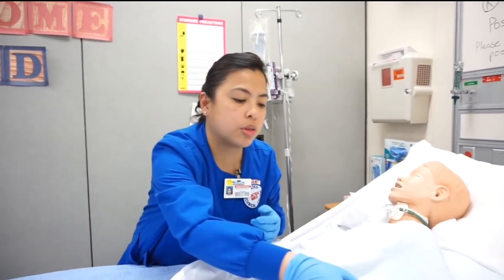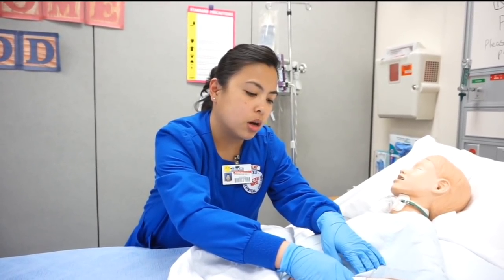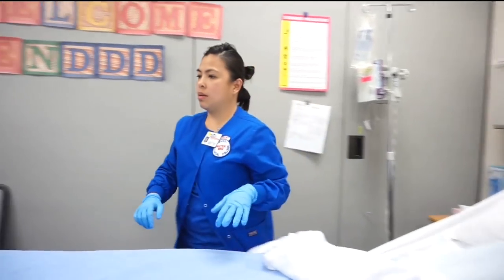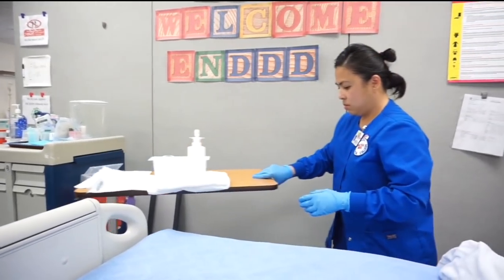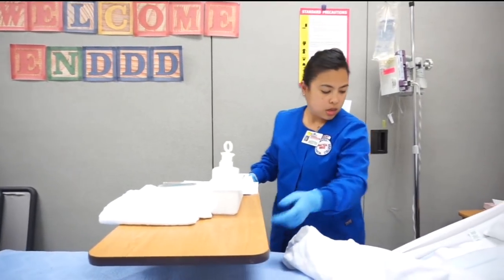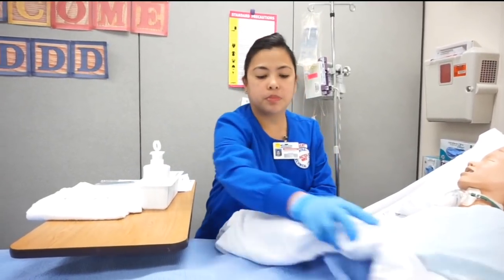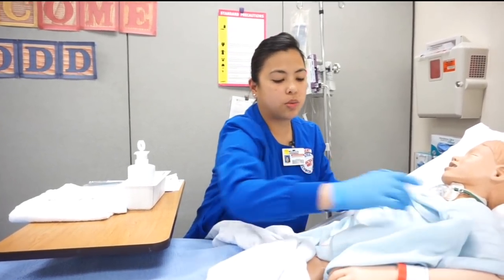Can you please tell me your first and last name and your date of birth? Alright, how are you today? Good. So what I'm going to do is gather my materials, raise the bed to a comfortable position.